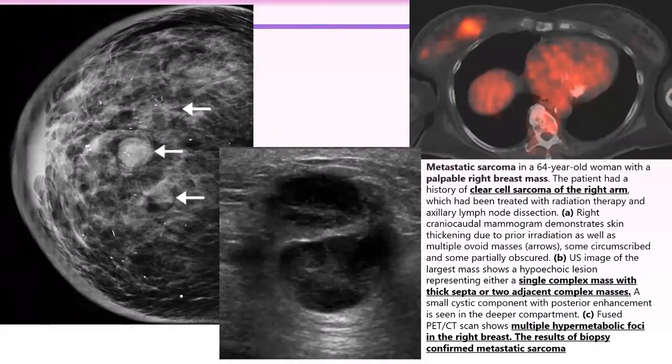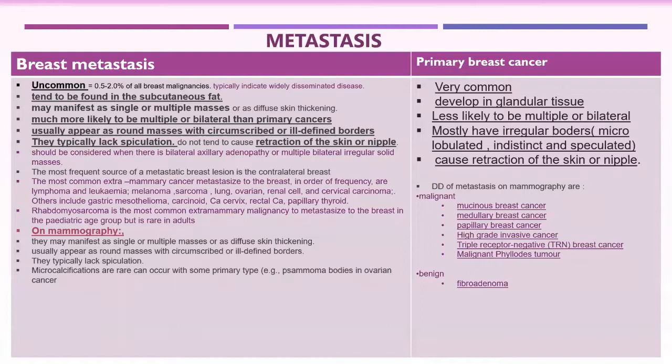The PET scan shows hypermetabolic foci, high uptake of FDG. Scintigraphy.